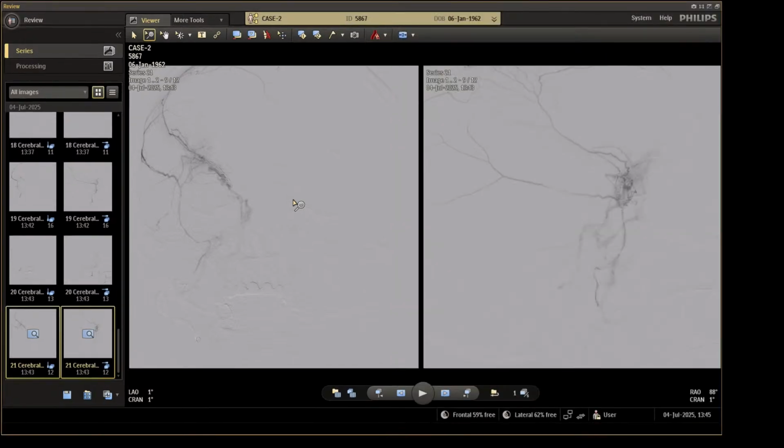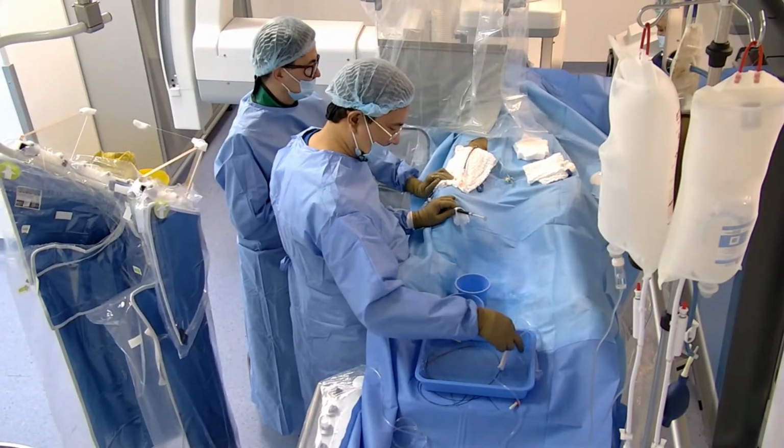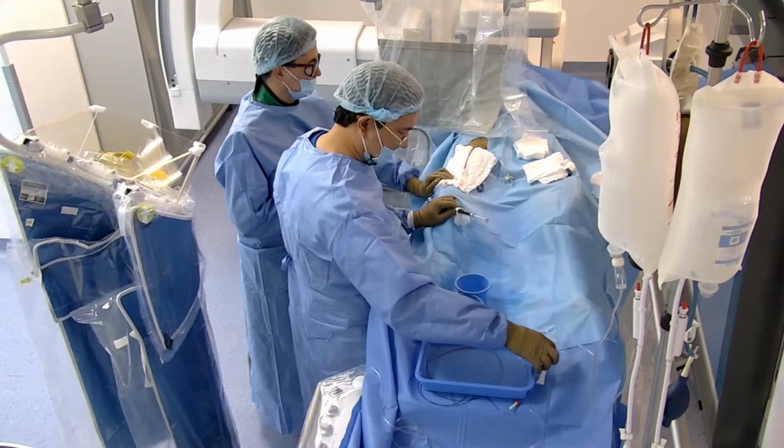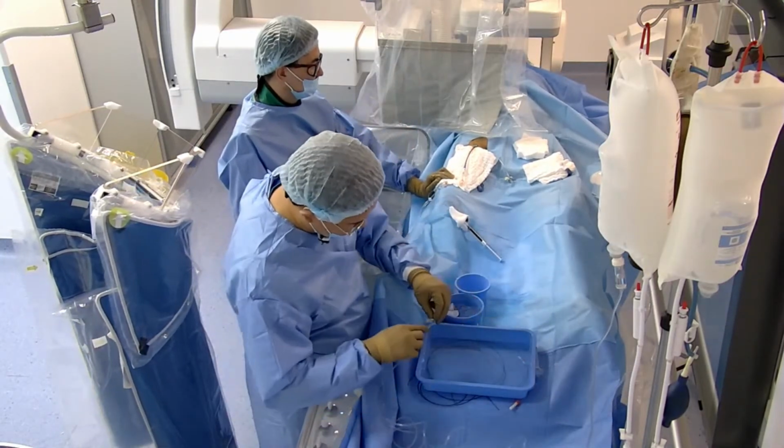Patient is moving. It's a good sign. The level of anesthesia is checked. Okay, I think it's the same problem in many places. In many places the same. That's why we're asking to make the anesthesia deeper.